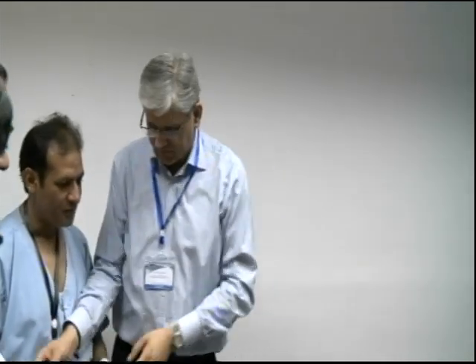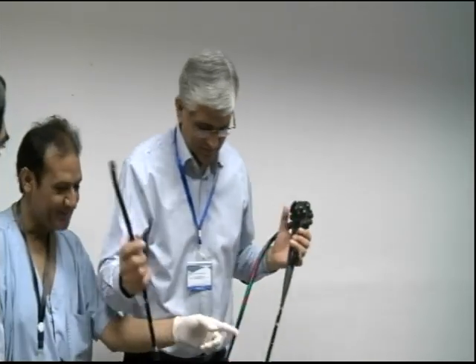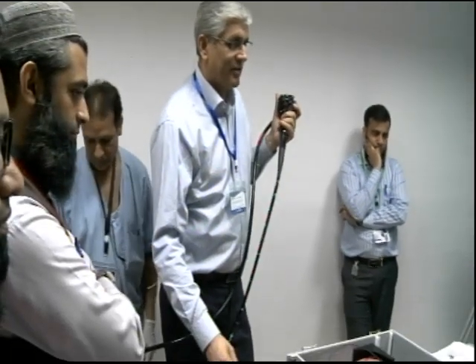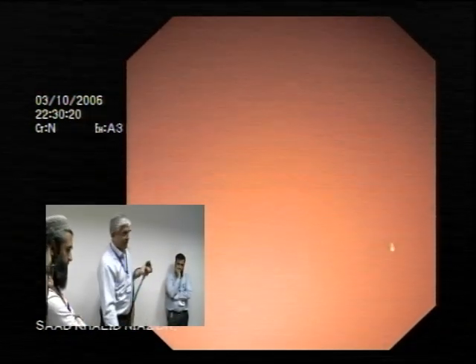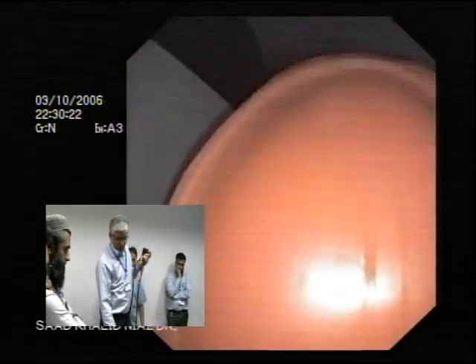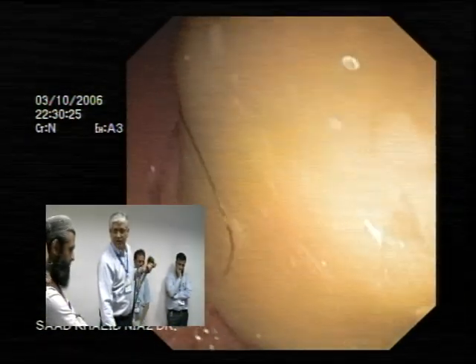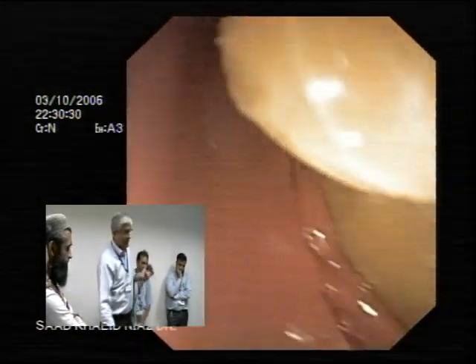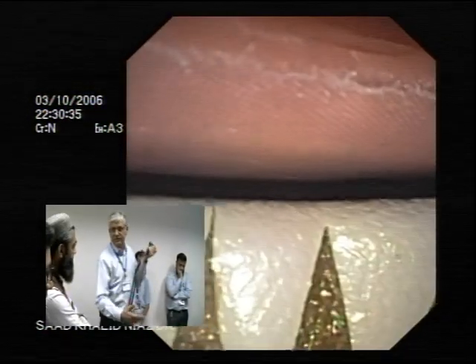So this is cannulation under vision, right? You can actually see the pharynx here and you go into the... So that's one way of going. If you think you're putting an NG tube, you can literally go blindly and just negotiate, and you should be able to achieve the same thing.